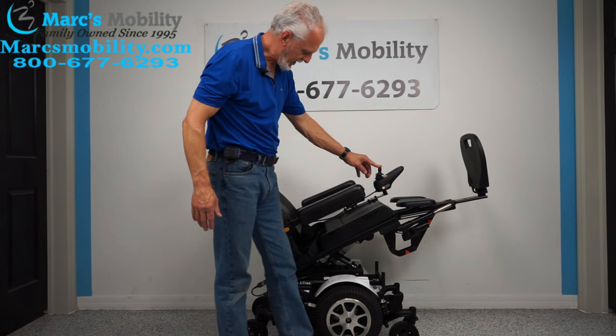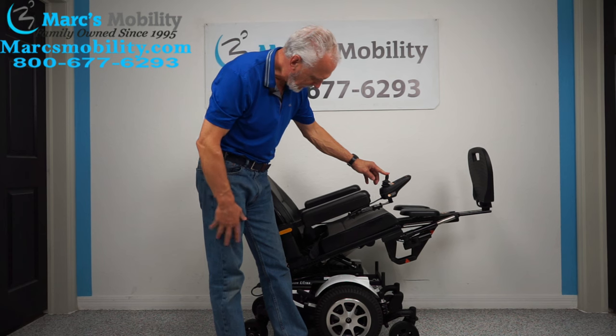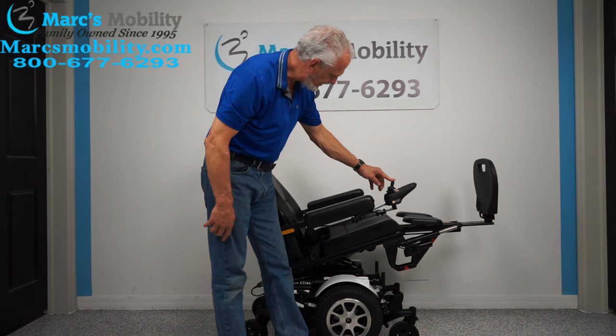It's a gorgeous looking chair by the way — I love the color white. It just looks classy and clean. You have suspension all the way around on this chair, which I'll cover in a minute.